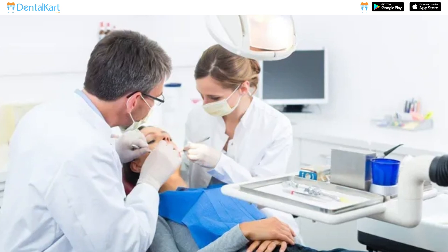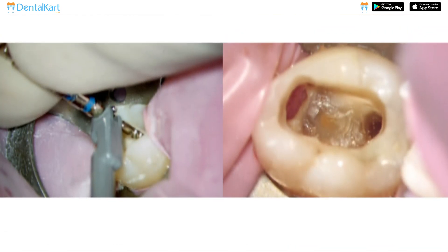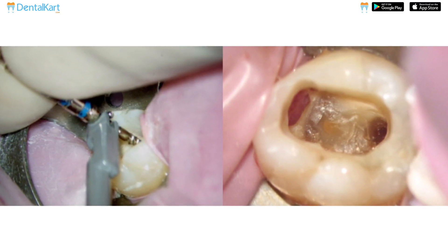In cases of re-treatment of a previously treated root canal, the Walden Paste Carrier can aid in the removal of existing obturation material.